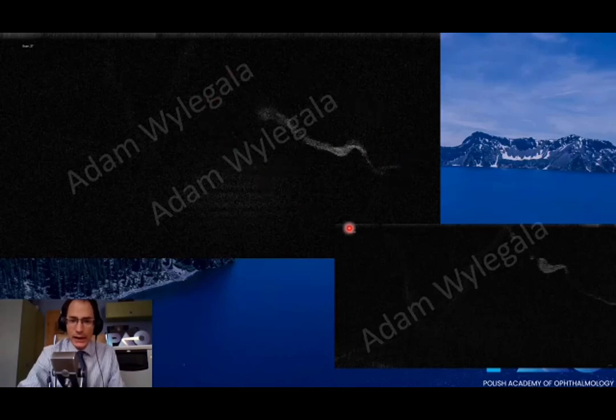It's pretty hyper reflective. It's pretty dense, and it's also pretty thick, because just remember, this is going to be more or less like 200 microns in thickness, or even more in some parts. So this is the floater. This is again the same floater, but a different size of the scan.